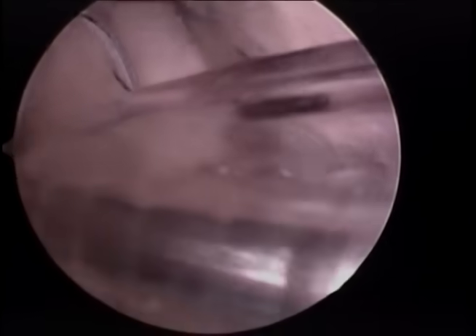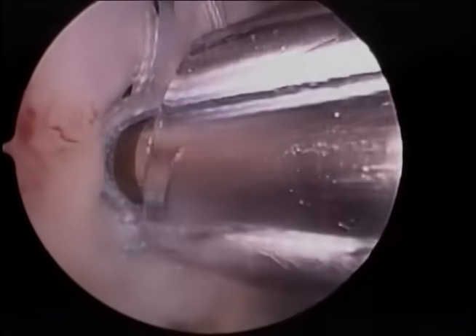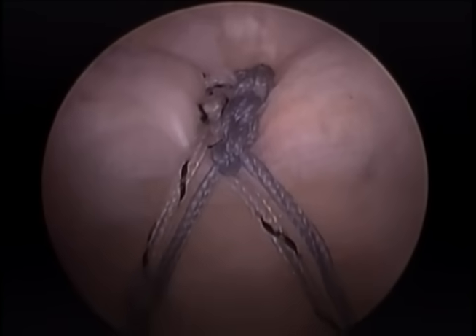These anchors give us an interference fit for the sutures laterally. They effectively create a double row rotator cuff repair without needing to place more anchors in the small greater tuberosity footprint. Here is our final repair viewed from the lateral portal.